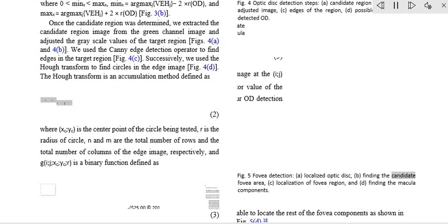In this work, we extracted a total of 177 features from a retinal image in order to determine the quality of an image. Our features can be categorized into 3 groups: shape, texture, and intensity. Shape features aim to represent the shape information of a segmented binary image. Given that we previously segmented a retinal image, we can use the shape features of the segmented image to express the vessel structure of the retina. We chose 2 shape features.